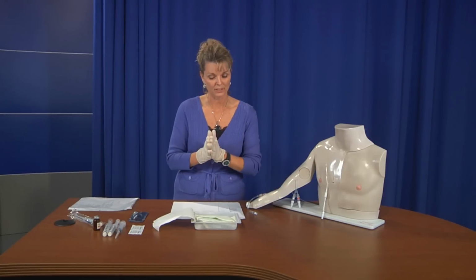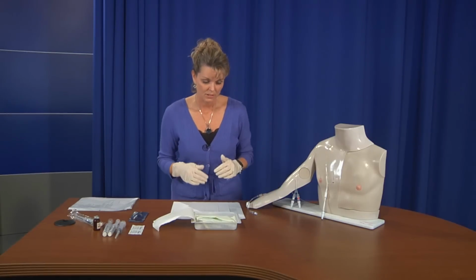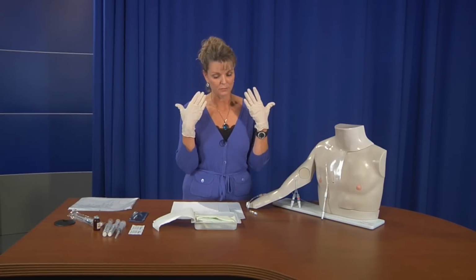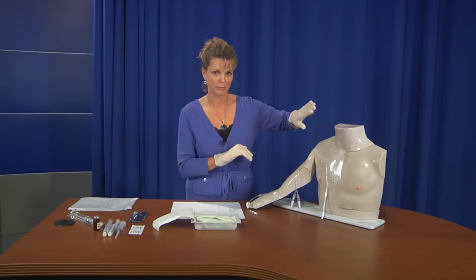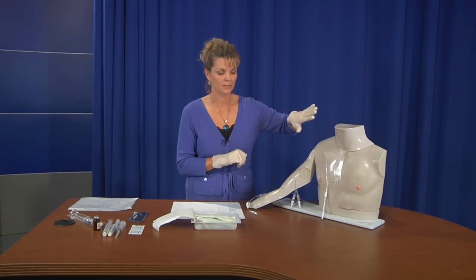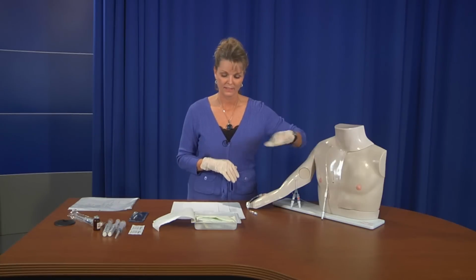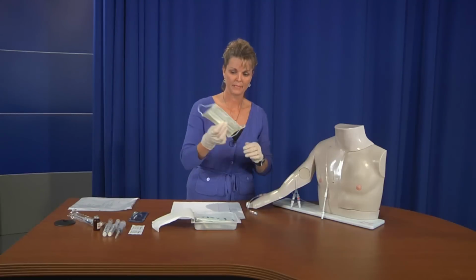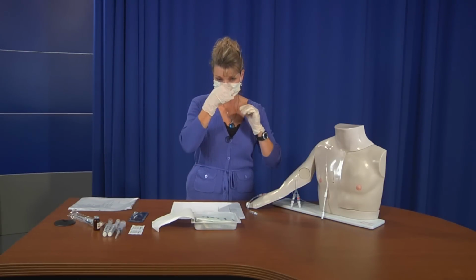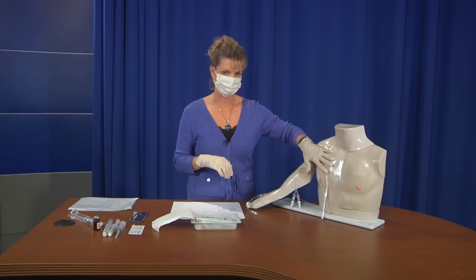So after we've applied our gloves, we want to make sure that we don't give the patient anything that we've brought in with us. So there's two things you can do. One, you can put the mask on, which you'll have to wear. The other part is you're going to put a mask on the patient if they can tolerate it. If they have shortness of breath or those type things, they cannot tolerate a mask. What we're going to tell them to do is turn their head to the side, away from the site. So we will put our mask on. And since I have one mask, I'm going to tell my patient in the position of comfort to turn their head away from my site.